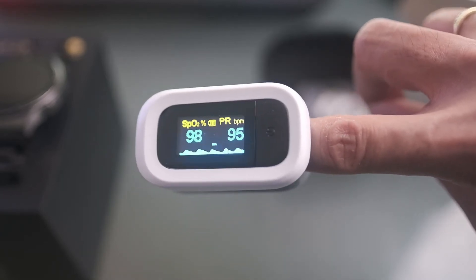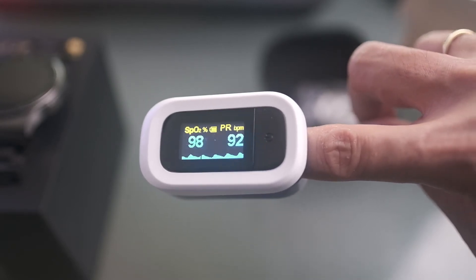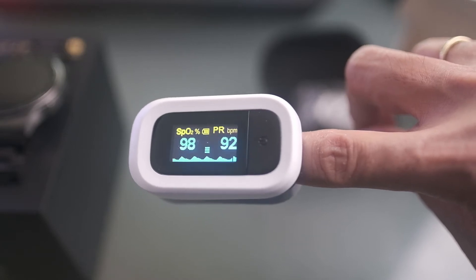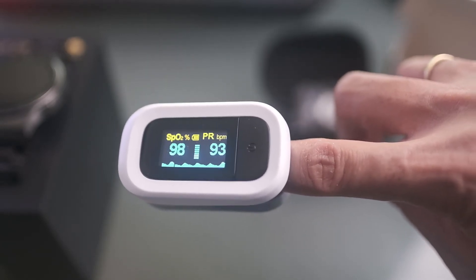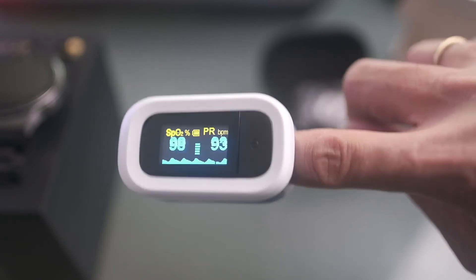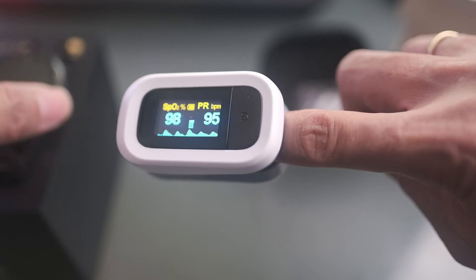It's reading 98%. This is a real-time pulse oximeter, and that's the advantage of this medical-grade device. Unlike the Huawei GT2 Pro, this gives a real-time reading.